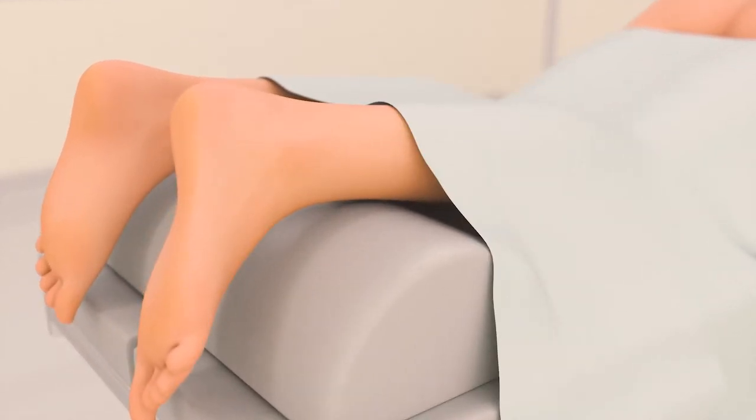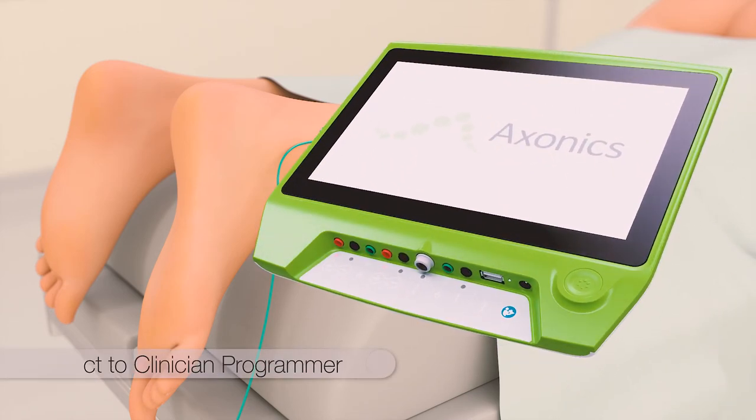Support is placed under the feet to allow the toes to be free to demonstrate motor responses. The ground pad is placed on the patient's leg and connected to the Axonix clinician programmer, which provides stimulation to test for responses.